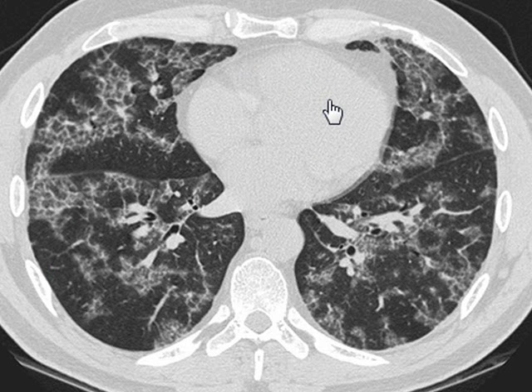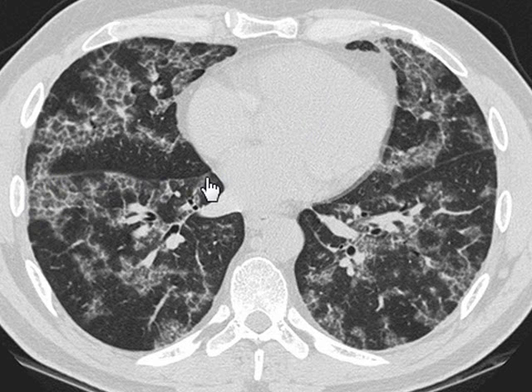Some other conditions can also produce this pattern, and those have been discussed previously with videos available on the website. Another important point for those interested in image interpretation: you can see two lines, one in each lung — these are the oblique fissures.